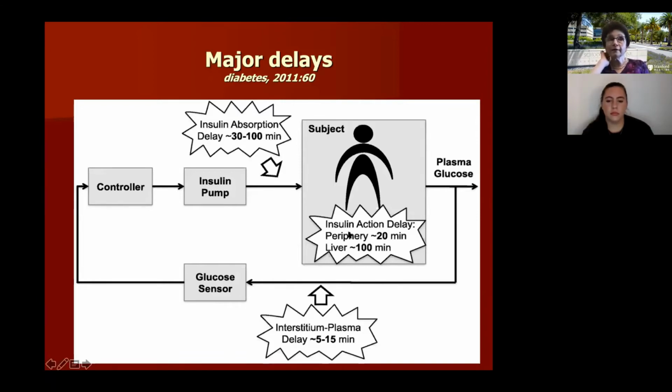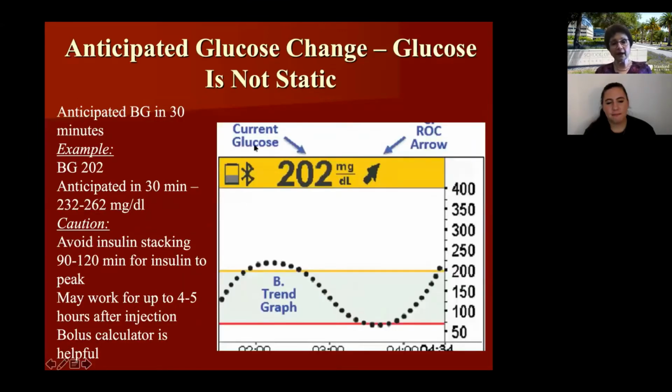When I go over this with a patient and they say, oh, I spiked 60 points, I tell them this is okay, because this is what's happening in the body. Unfortunately, with just insulin, you cannot cover all the functions. Many studies have been done, and we were debating which talk to do for this session, either CGMs or adjunct therapies. I'm more than happy to answer those questions, because I'm a big proponent of that, since insulin alone cannot fulfill all the functions that the body is doing.